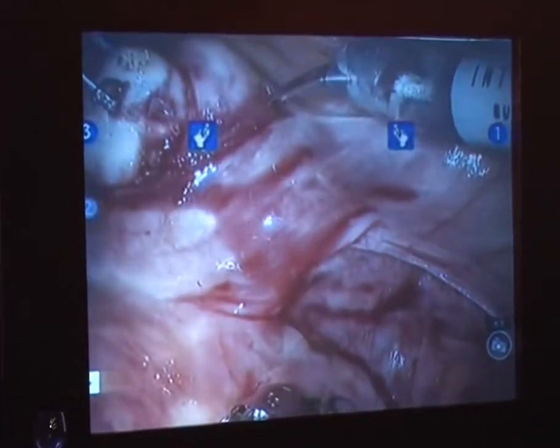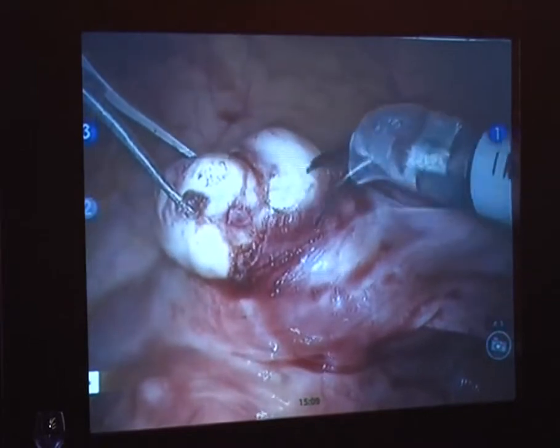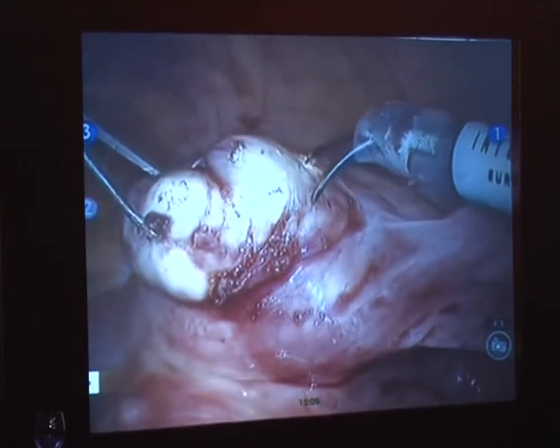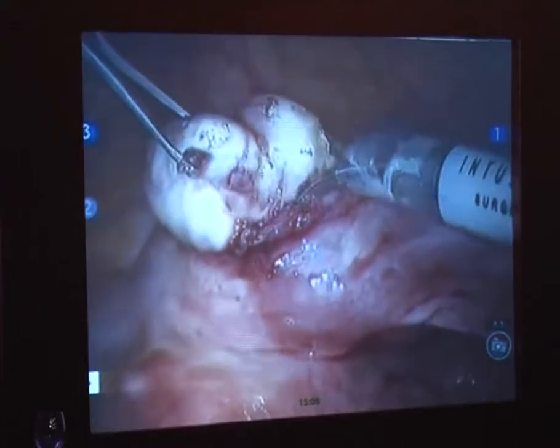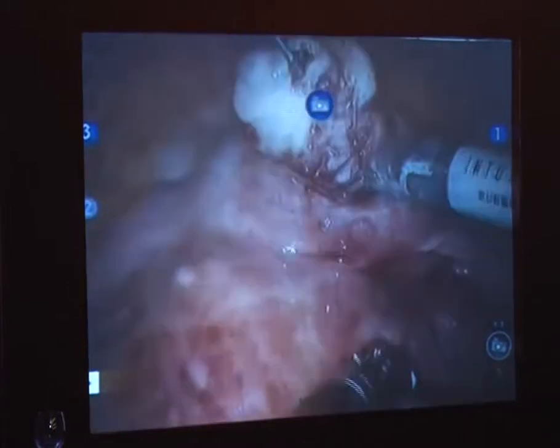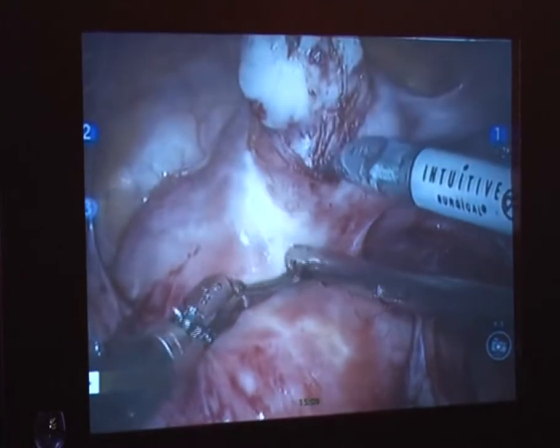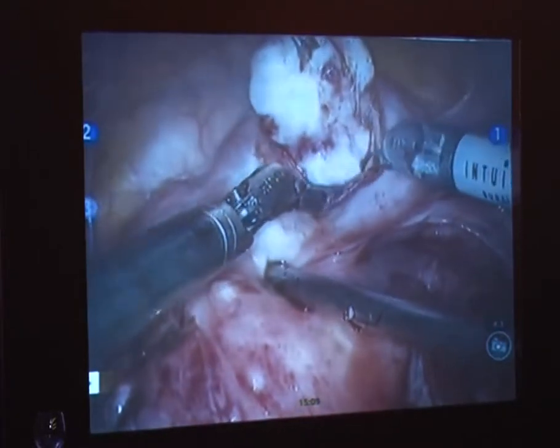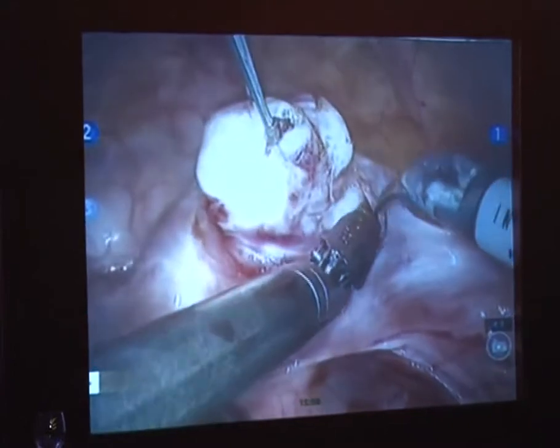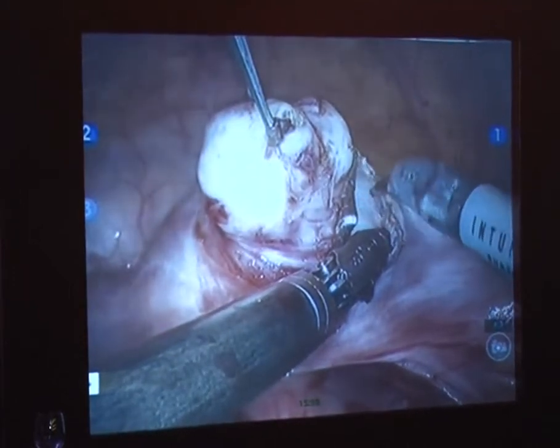The key also to get the maximum range of motion is to keep your arms in neutral position and constantly clutch. As you see, Arnie's arms are in neutral position. That gives him more range of motion too. Now there are times where you can see that I'm going to run into a collision here eventually, so I'm either going to be able to correct the collision internally, or I have to switch the orientation of the arms so that I can pull this thing out. So we'll see how this goes.